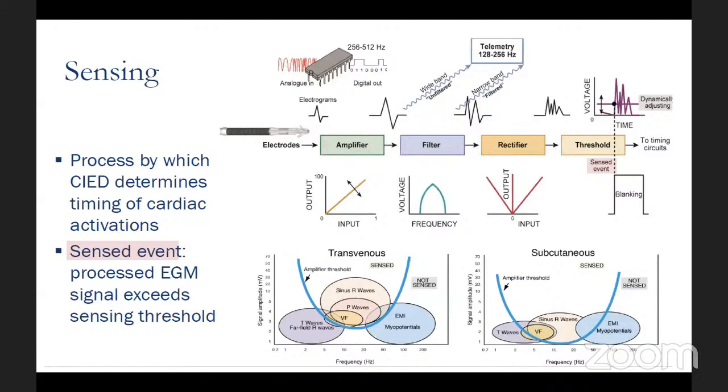The other thing is, I agree with you about what stuff you are able to use or not to use for pacemakers in general. Anything, as you said, can be used in the house except high voltage electricity and high magnet voltages, and anything that will interfere electrically with the device.